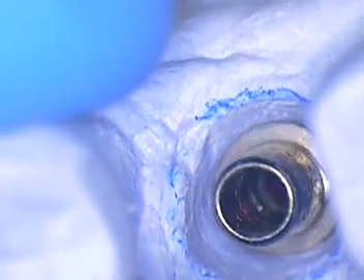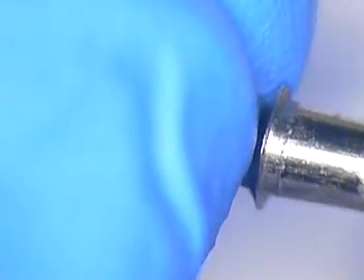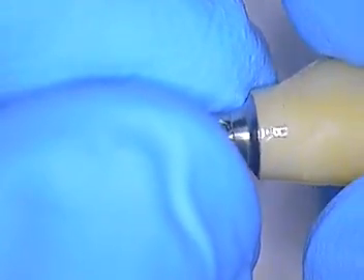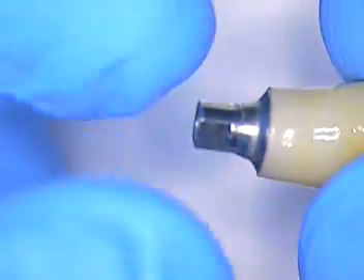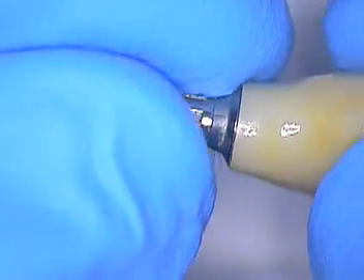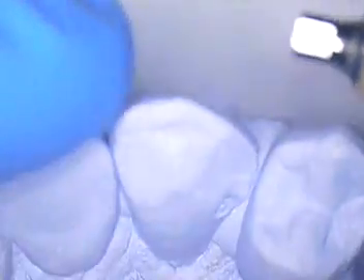I'll be talking to my lab and we're going to come up with a solution, hopefully, that will help future cases and allow this to go all the way down. There's some modification I'm going to do. I'm going to try to do this video in two segments so you can see what we come up with. This butt joint is too sharp and too raised, so it won't seat on the solid model. They would have to, by hand, cement this and then trim that lip away, which is quite time-consuming. There's got to be a way to maybe eliminate or reduce the rim so the computer scans differently, or put the two together and re-mill this so it can go back on the solid model.